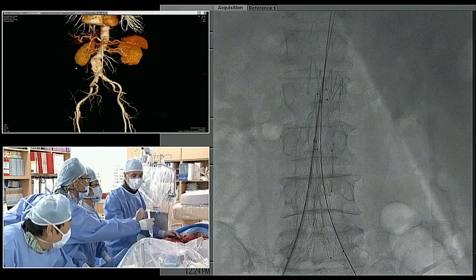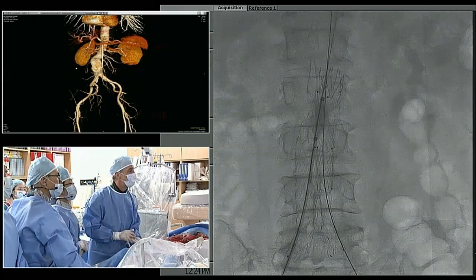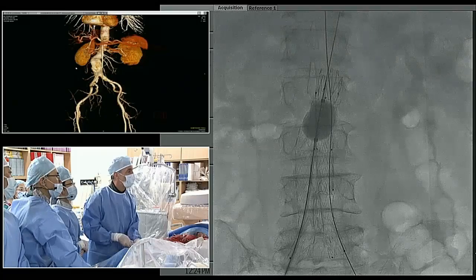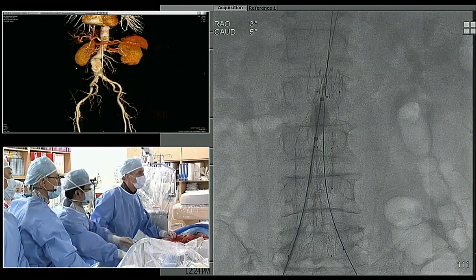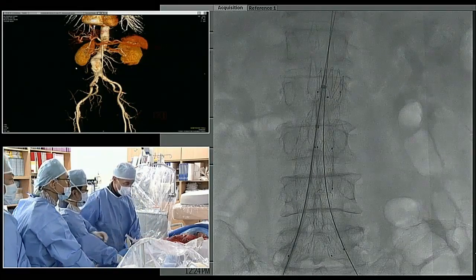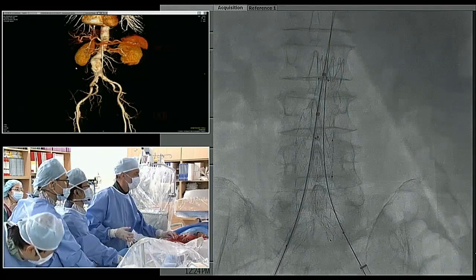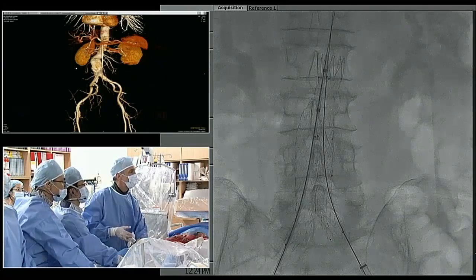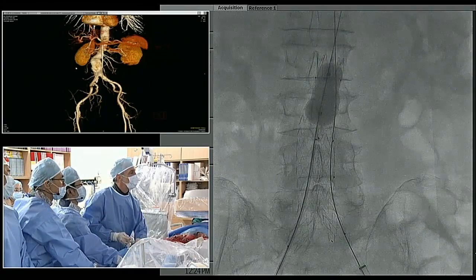So this is a Reliant balloon? It is, yep. So again, maybe we'll push that fabric up a little higher and press and mold it. Might want to go just a little higher. Push that up a little. Yep, exactly. There we go. Actually, you can go ahead. It's got a little bit of an angle there, so that's what we missed. So he's going cranial to eliminate the parallax. That's much better. That's good. Yep, that's good.